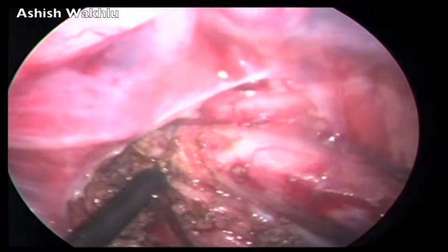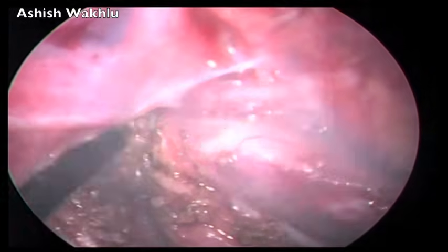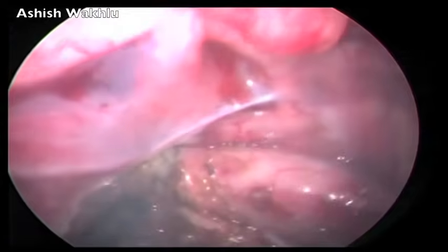At this level, we begin to see the pink mucosa of the fistula in the center, and we can appreciate really how thick the wall of the rectum is as it is getting divided.